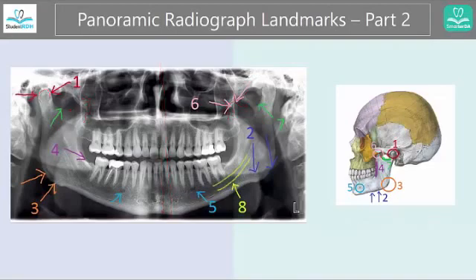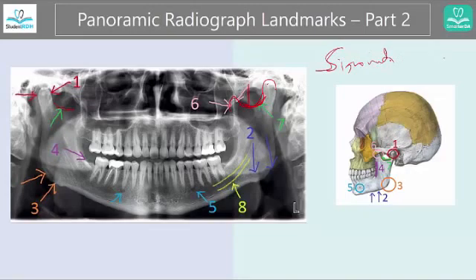Almost there. Number seven is called the sigmoid notch — this dipping part between the condyle and the coronoid process. Just take the 'S' and think about the curve, like the curves you would have between the condyle and the coronoid process. I think you can remember this now.